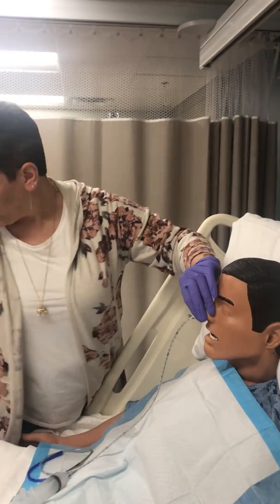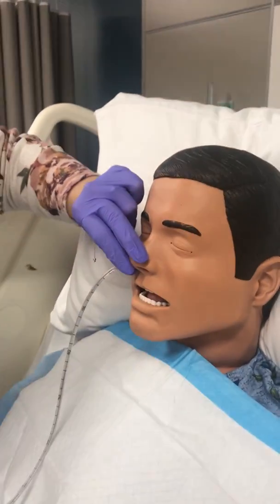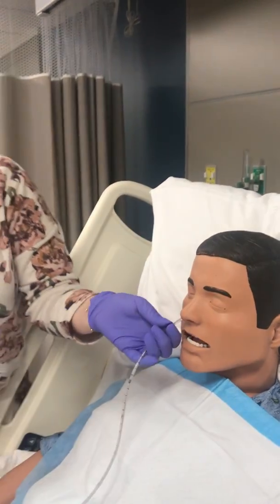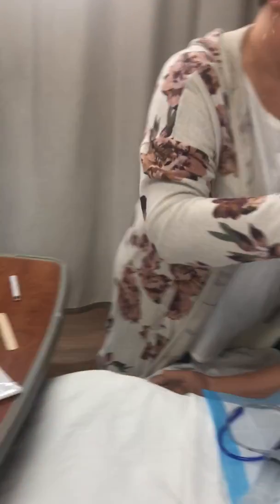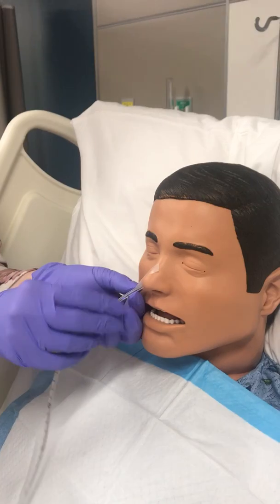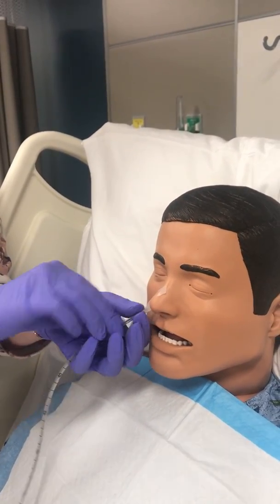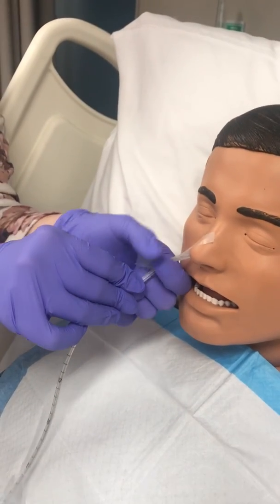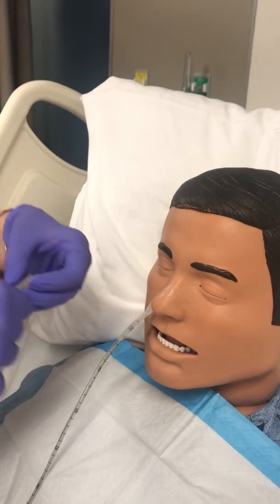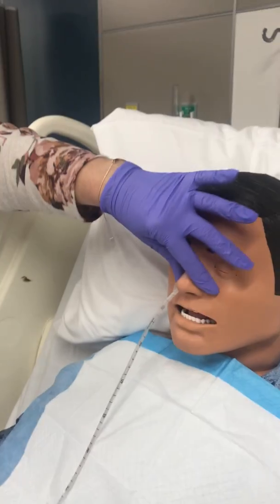If my patient's alert and oriented, I can say good job, open your mouth — the hard part's over. I can see the tube going down the back of the throat. Now I'm going to tape, like we talked about, down the side of the nose, around the tube so it reaches distally where it's dry. You can also put that optional piece of tape over the bridge of the nose if you wish — kind of nice for reinforcement.